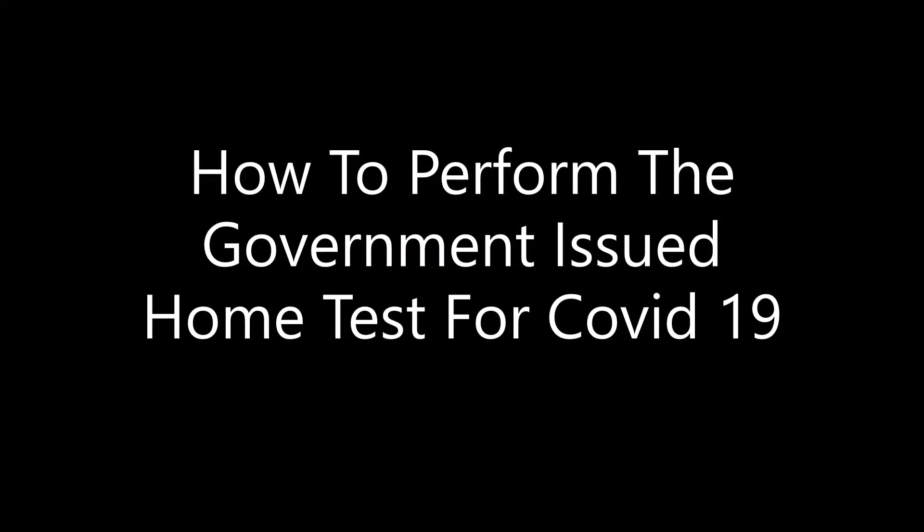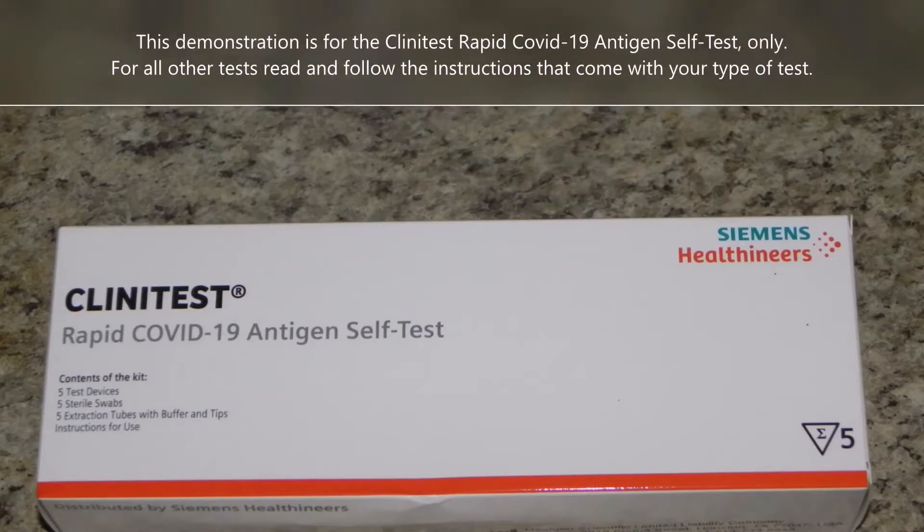This demonstration is for the CliniTest Rapid COVID-19 Antigen Self Test only. For all other tests, read and follow the instructions that come with the box.